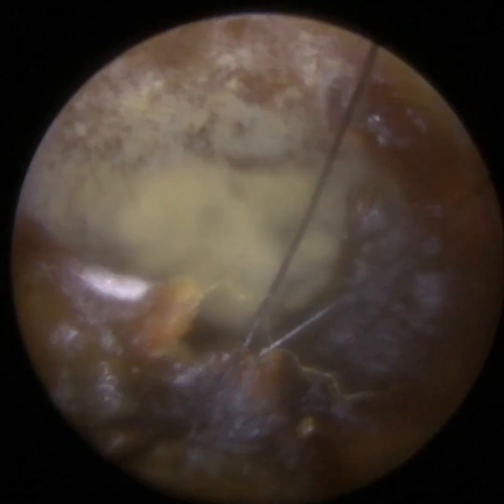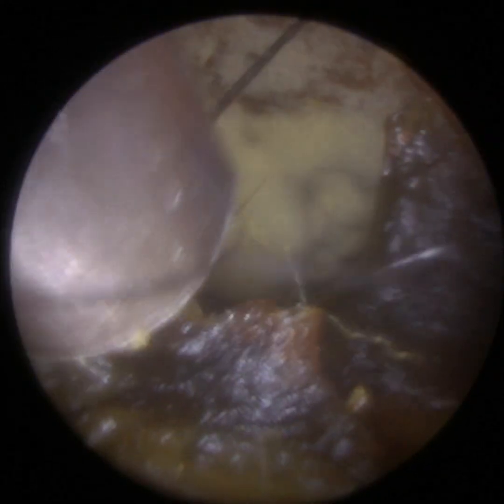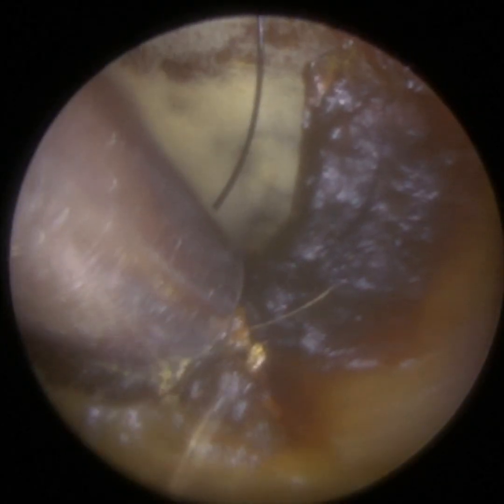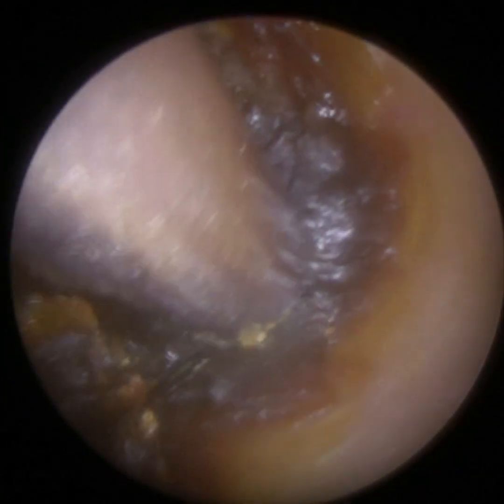It was really impacted. So I did explain to the patient, please try to refrain from this because we did discuss it last time. The patient reports itchy ears, so the otomycosis, you can see the white layer at the back, and around the edge you will see some spores. It looks like cotton wool fibres.